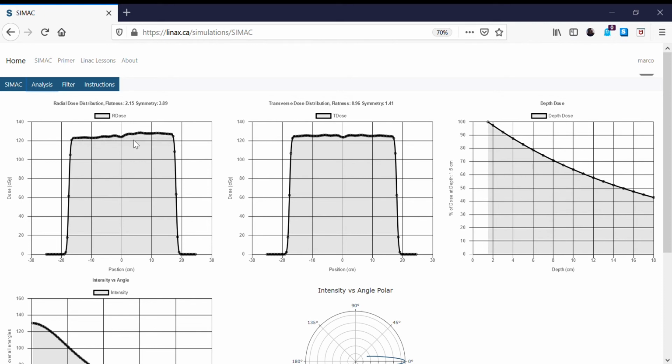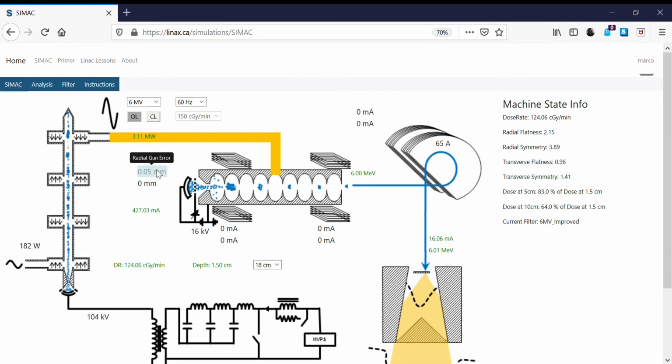We can do this by steering the beam back towards the center of the target. I've adjusted the radial gun error, and we've validated that by doing our profiles and seeing that the beam is not symmetric in the radial direction. Again, we have 3 sets of coils: the radial coil, the buncher coil, and the angle coil. These are the normal coils in a Varian style linear accelerator. I'll start by increasing this number to, say, 50 milliamps going through the radial position coil.